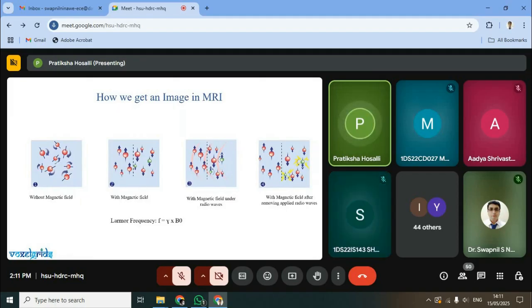So, basically, MRI is magnetic resonance imaging. The magnetic field of our company's magnet is 1.5 Tesla. If we place the patient's body inside the MRI machine, the hydrogen protons will align with the magnetic field of the magnet. As you can see here, if we assume the magnetic field is in this direction, some hydrogen protons align parallel or anti-parallel to the magnetic field of the magnet.